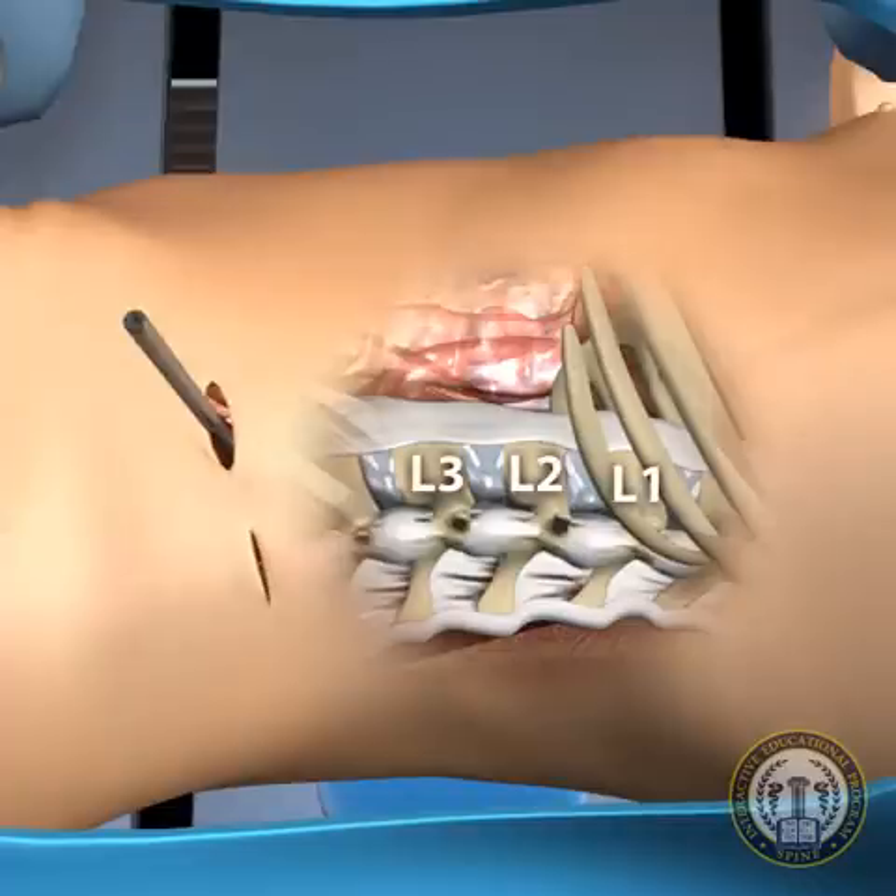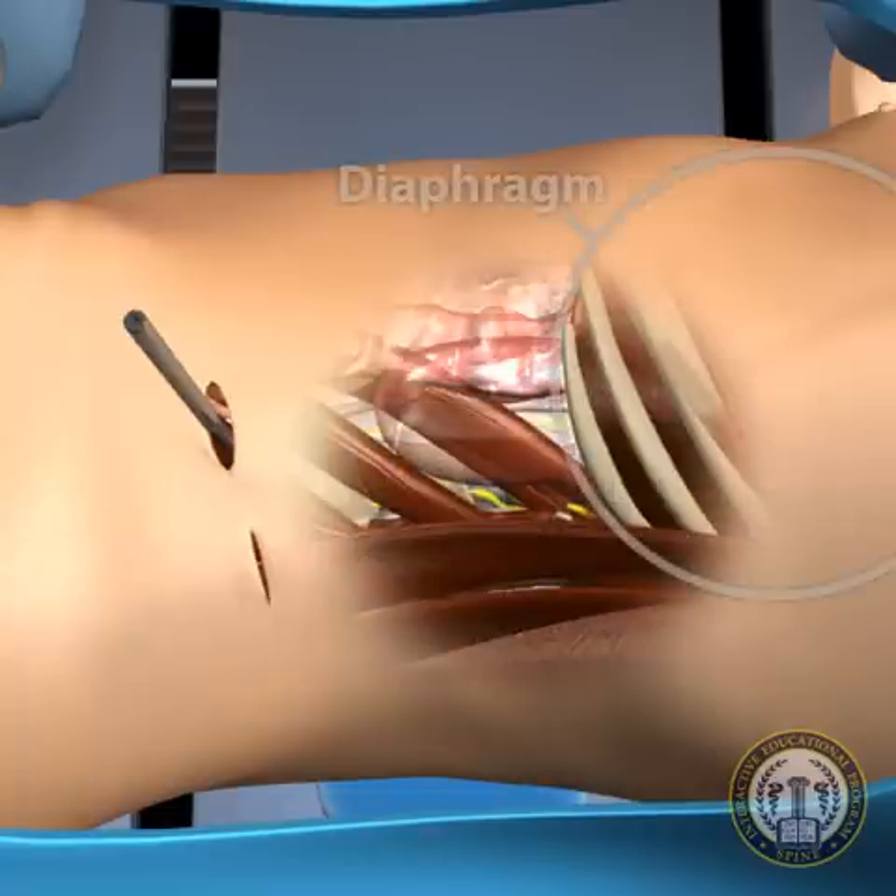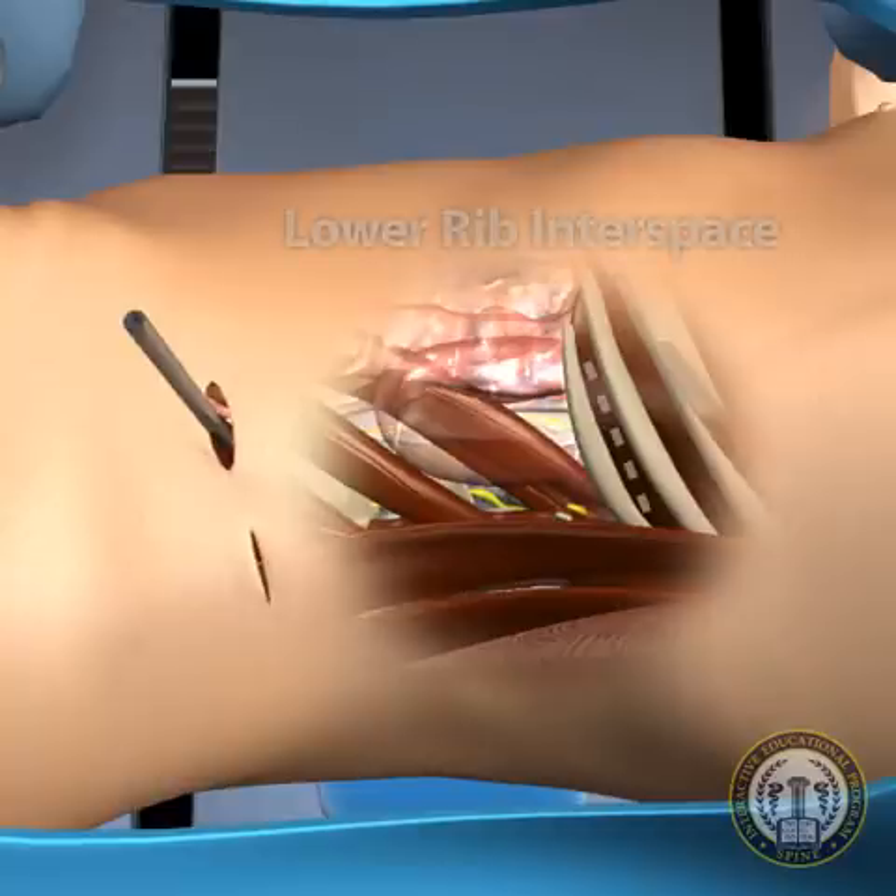For upper lumbar L1-2 and L2-3 approaches, the retroperitoneal dissection is brought directly under the diaphragm. It may be necessary to perform the lateral approach between a lower rib inner space.